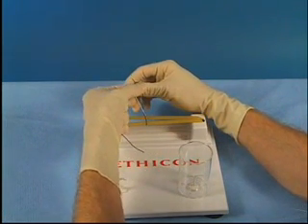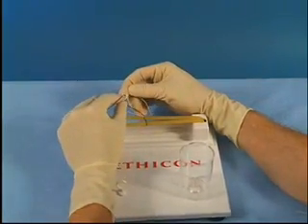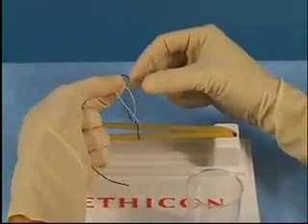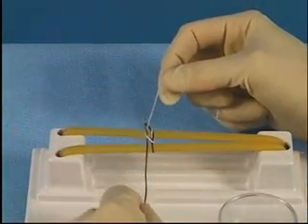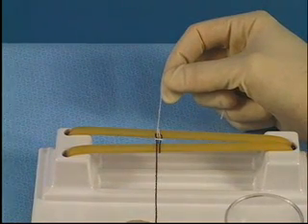The thumb and the index finger are opposed. The hand is rotated so that the suture material may be grasped, pulled back through the loop as the hand is rotated back, and now the hands are pulled in the opposite direction with the left hand pulling down and the right hand pulling up, forming a square knot.